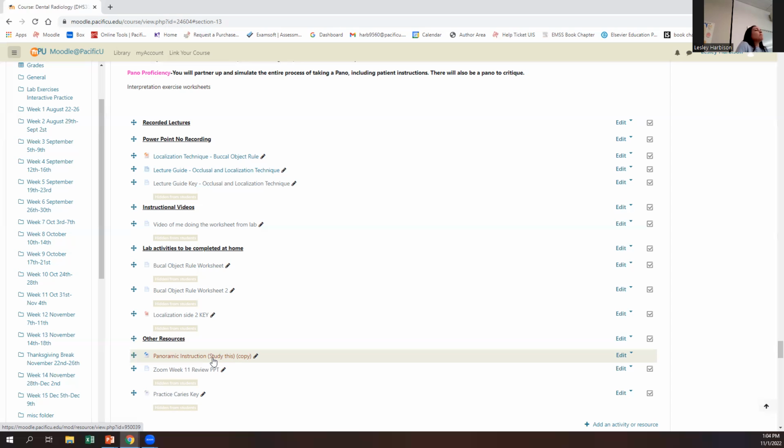And if you do miss something, it's fine. You just miss a point or so. However many points you have, you have to pass by 75. So if you don't do it perfect, you can still pass, but you want to shoot for getting all those steps in. And then you'll press the button. It'll be on test mode, goes around their head. And then you walk them out, take off their apron.